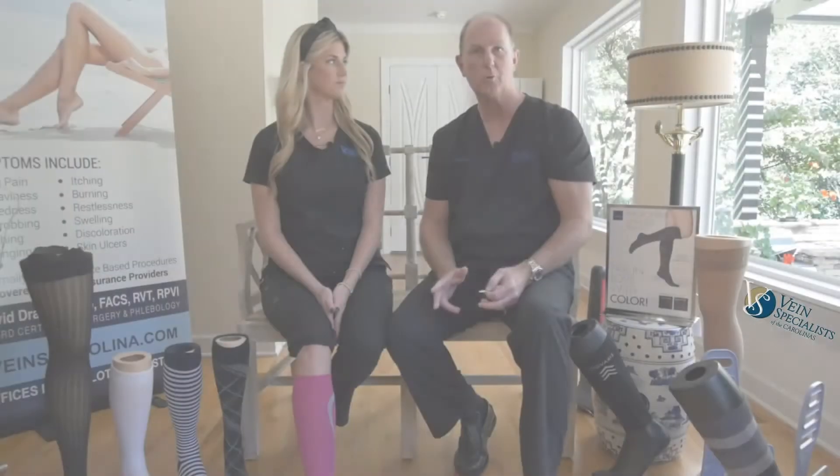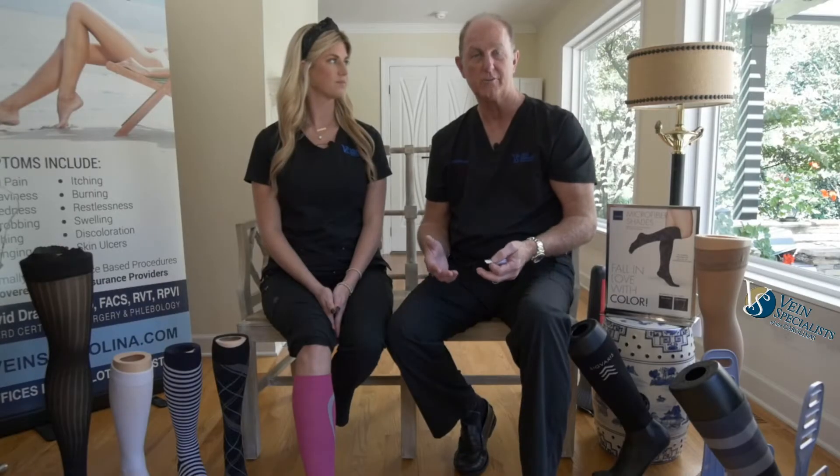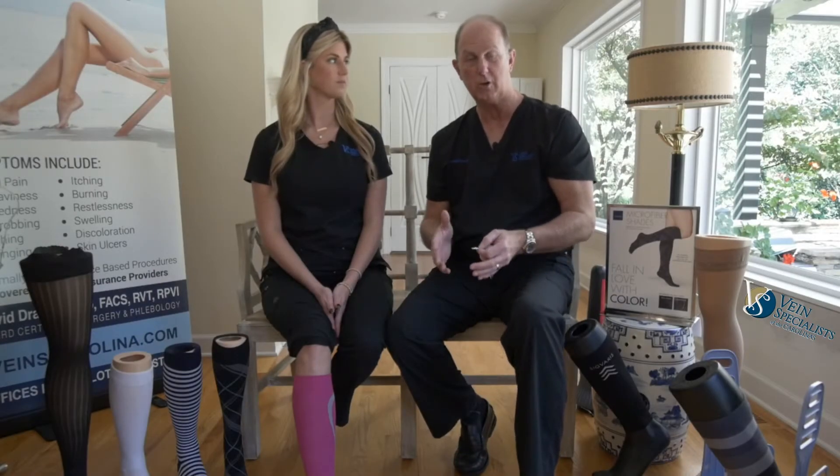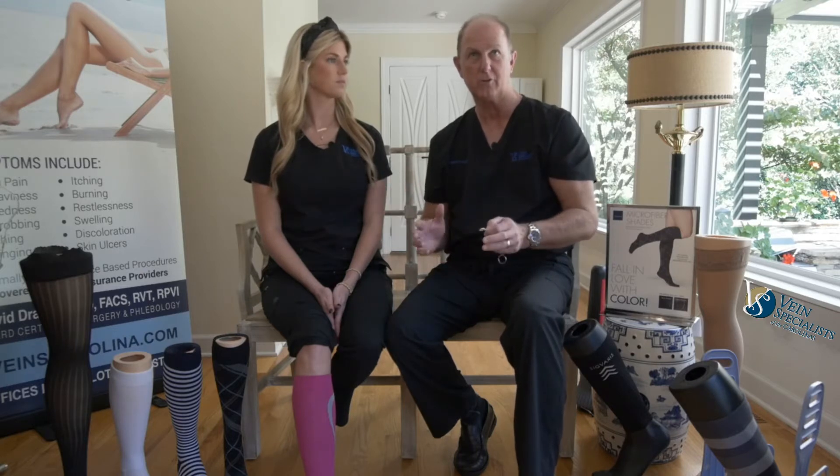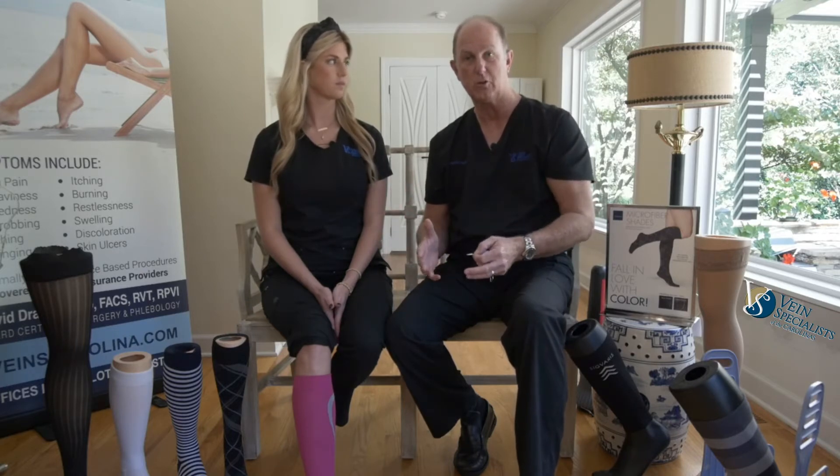The two most important things about garments is they have to fit your leg. You can't get your mom's, dad's, daughter's, or sister's garment and try to wear those — they have to fit your leg. When we measure patients, you're going to fit into a category of small, medium, or large, and you might be at the top end of medium or the bottom end of large, so there's some variability.